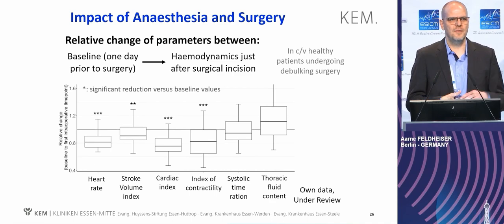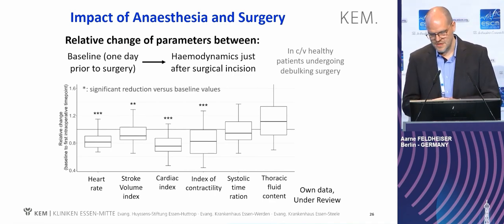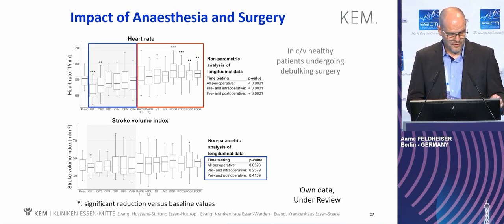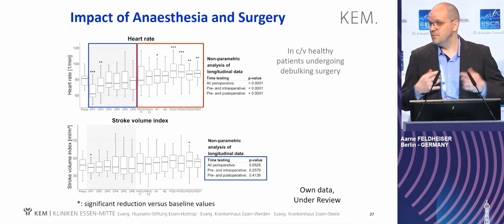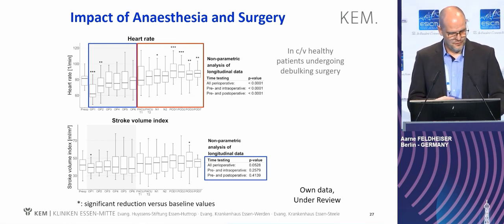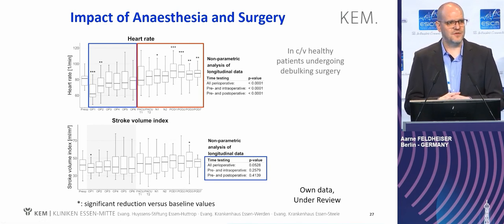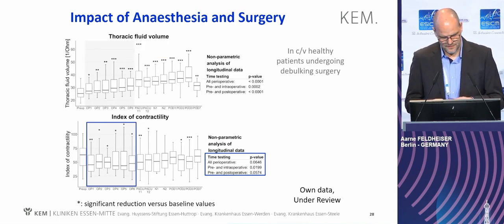We have to go back to the measurements prior to the surgery. And this is something offered by this methodology to perhaps in the future better assess our patients. The interesting point for me, and perhaps I'm a bad anesthetist, was that during surgery the heart rate remained lower than the previous preoperative values, and after surgery it was statistically significantly increased. So we have a certain pattern of patients undergoing the perioperative pathway, and this was based on no alterations of stroke volumes during the perioperative course.